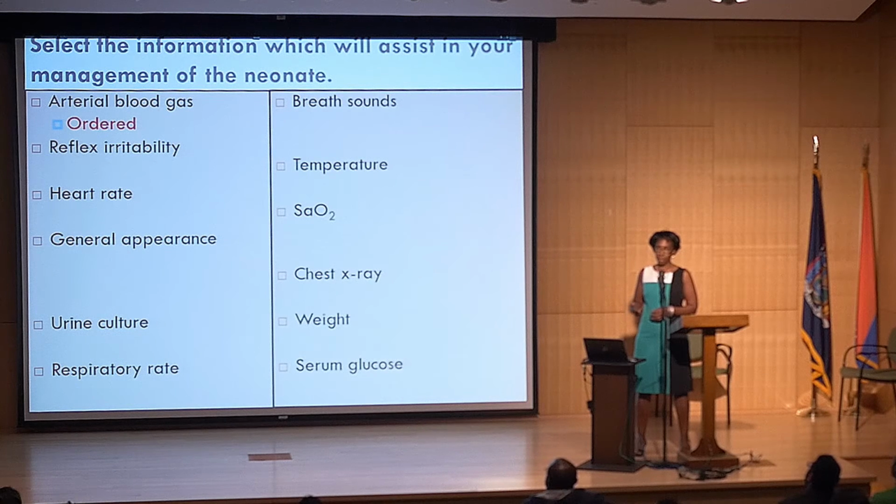So the odds are that blood gas is going to be probably like a respiratory acidosis and probably some metabolic component as well, metabolic acidosis. So if you got that blood gas right away, you're going to be treating a situation that may have to change. So you might as well wait to stabilize the baby and then get the blood gas.